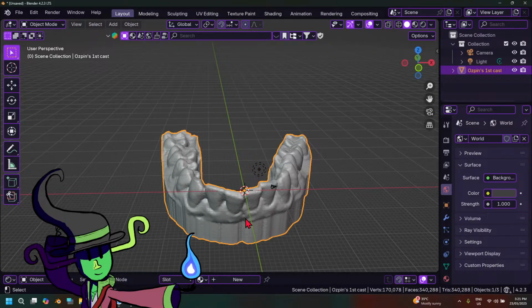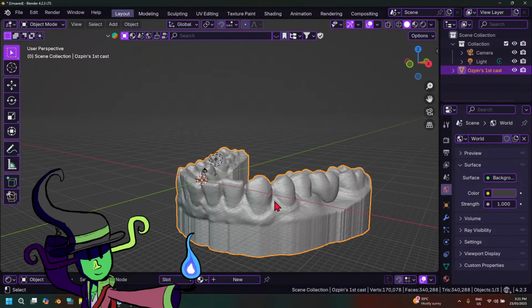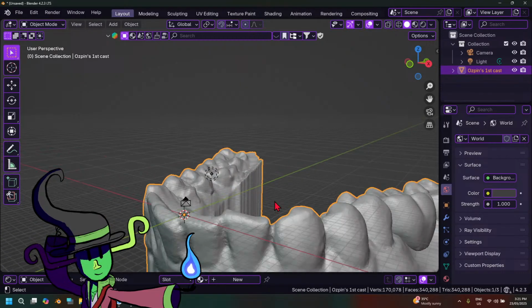But anyway, I'll share with you guys, with dentists here in my live stream, some tips. Say for example you want to sell your patients on a product that you're gonna create in a CAD software, but your patient is like, nah, we don't want to do this.